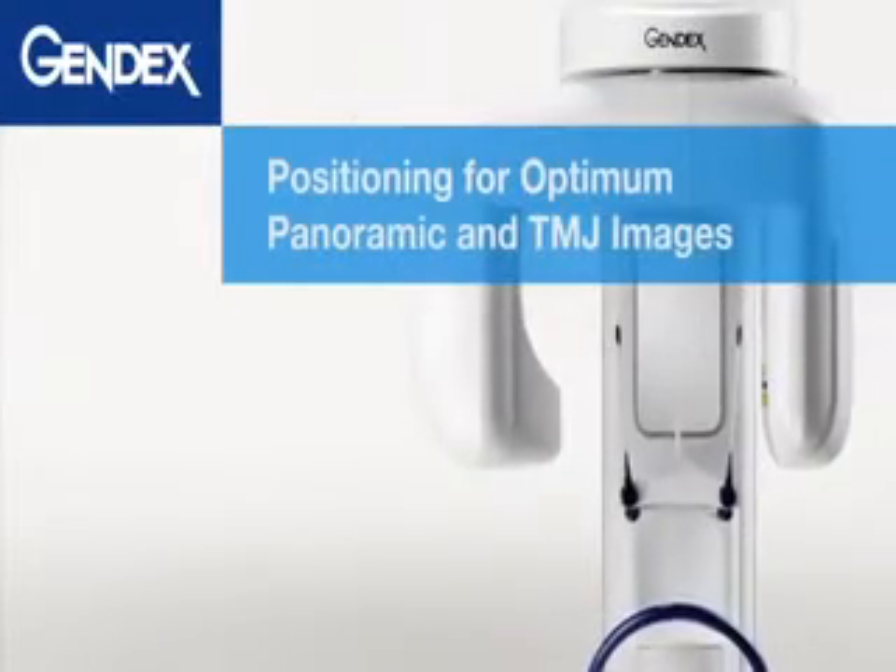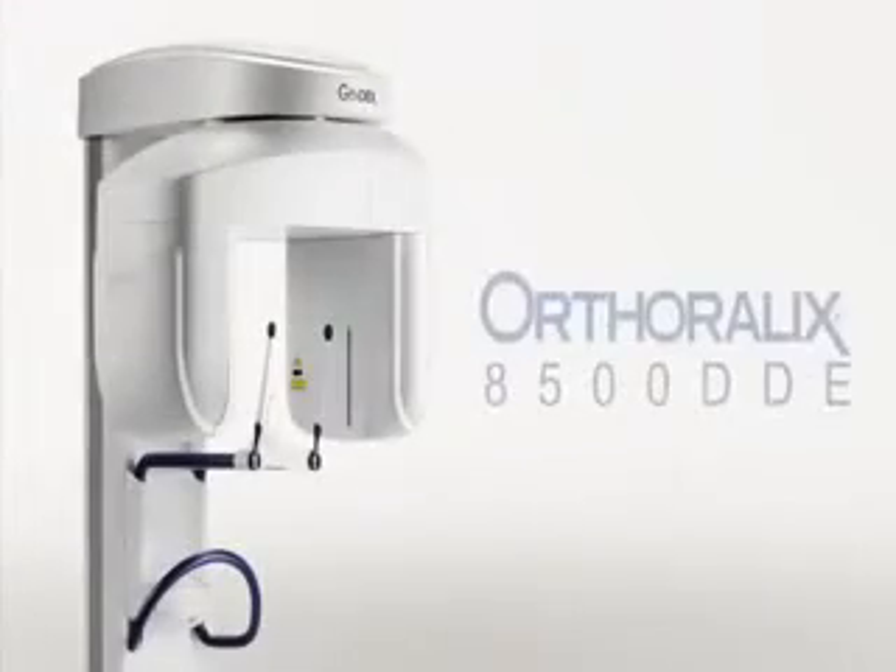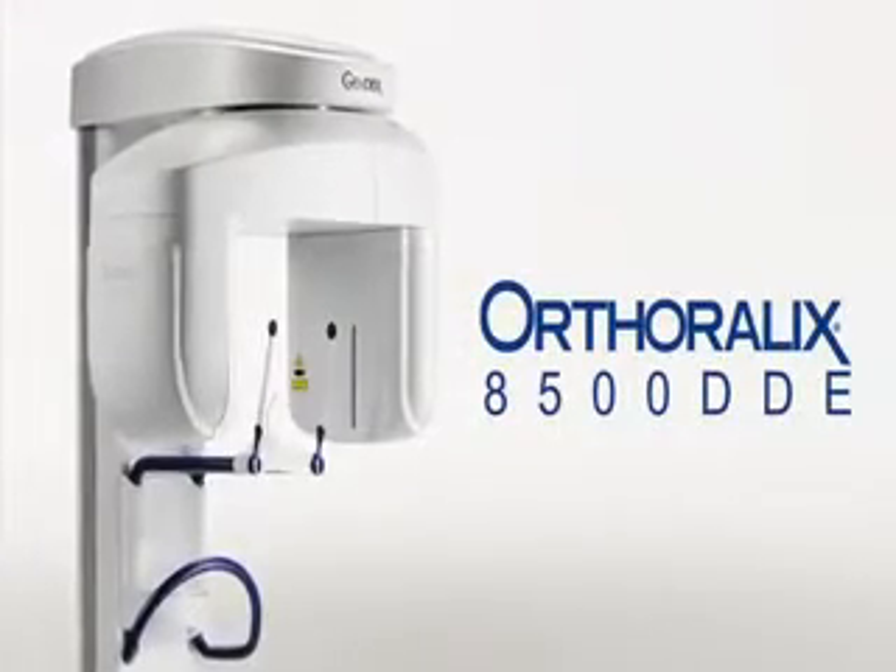Welcome to the training video on positioning for optimum panoramic and TMJ images using the Gendex Orthoralix 8500 DDE.